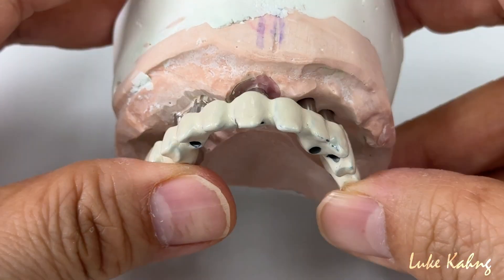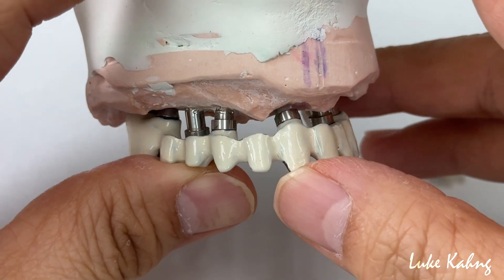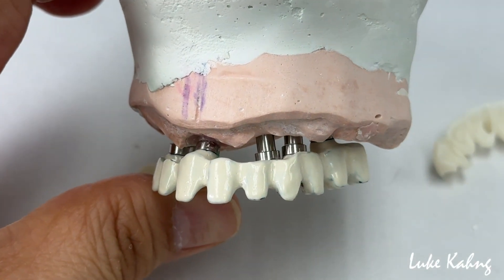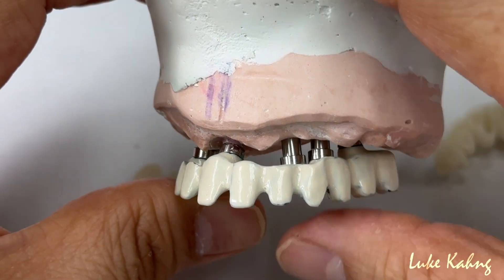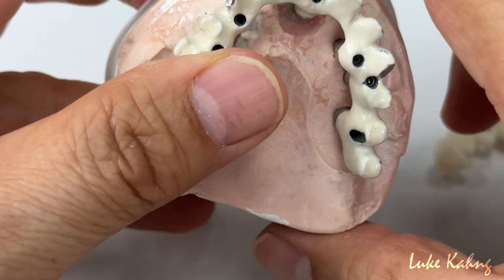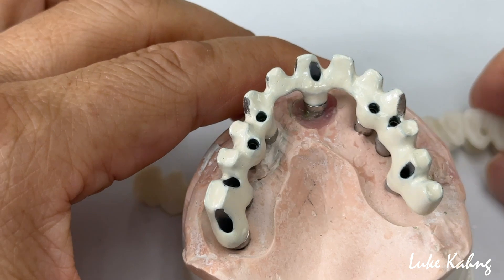We will pack it in either the same color or one tone lighter. Dr. Swan, the final colors are one and two — we make this B1, which is better. So due to strength considerations, we proceed with B1.